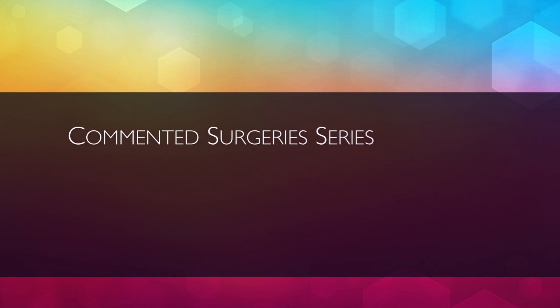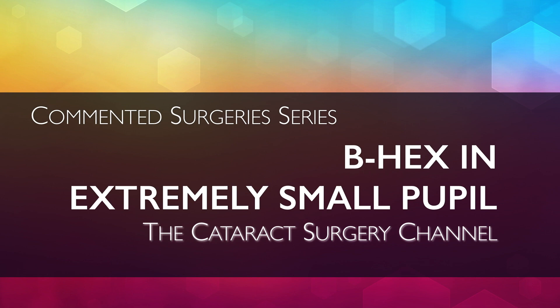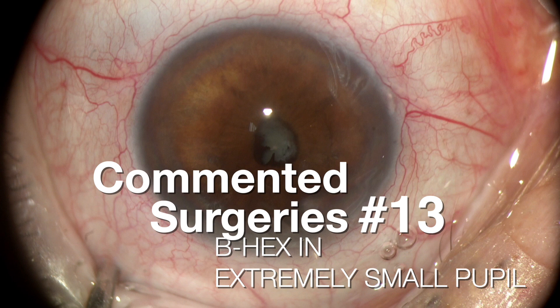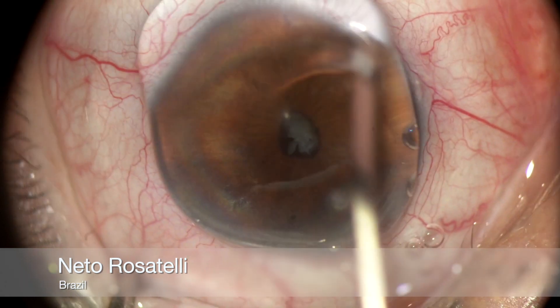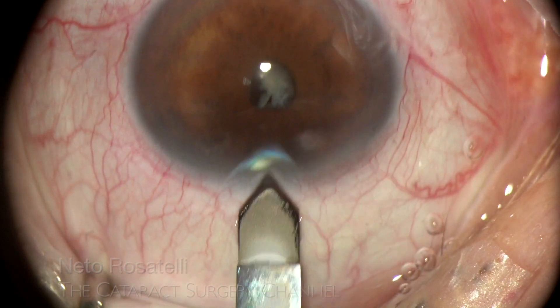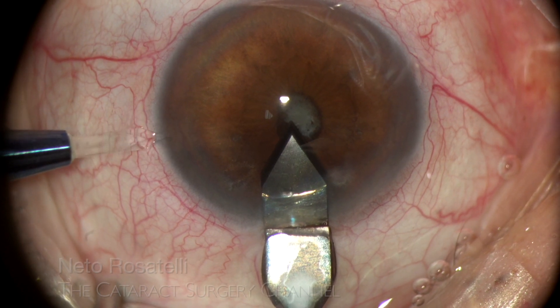Hello, my name is Netto Rosatelli and welcome to the Cataract Surgery channel. This commented surgery shows a case with a very small and slightly fibrotic pupil, with pupillary adhesions and an anterior peripheral synecchia due to trauma. The case was approached using the B-hex pupil expander in a bimanual insertion technique, allowing for easier and automatic pupil engagement in very small pupils, without resorting to pupil stretching.